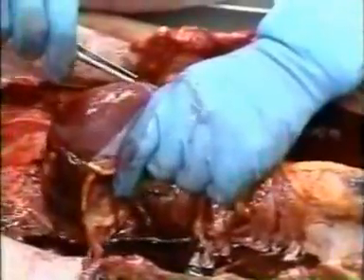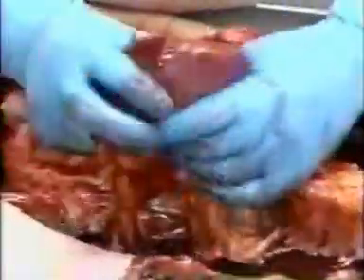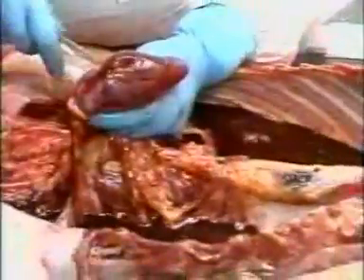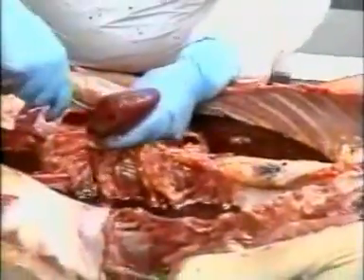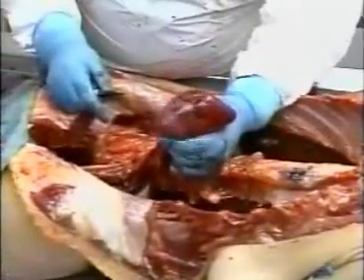Now he's incising the renal capsule, which is a thin membrane that surrounds, right there, that surrounds the kidneys, and he'll strip that back to expose the kidney itself and then remove the kidney.